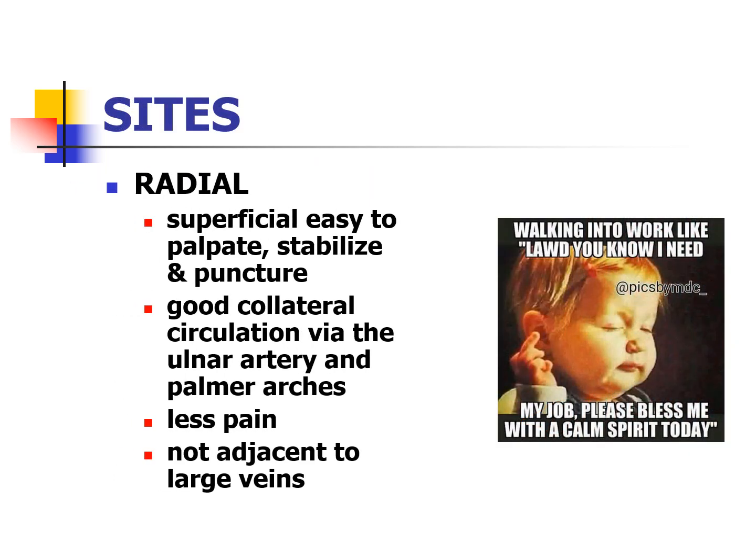So the radial site, it's pretty superficial. That's one of the reasons why it's the preferred first choice for blood gas. Superficial, easy to feel, because remember, you can't see the artery. Unlike the veins where they could put a tourniquet on, most patients, you cannot see the artery. Very, very rare you can, unless you're looking at like the little super premature babies in the NICU.